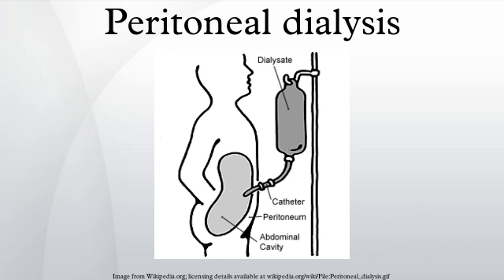Two complementary models explain dialysis across the membrane, the 3-pore model and the distributed model. The high concentration of glucose drives the exchange of fluid from the blood with glucose from the peritoneum. The solute flows from the peritoneal cavity to the organs, and thence into the lymphatic system. Individuals differ in the amount of fluid absorbed through the lymphatic vessels, though it is not understood why.